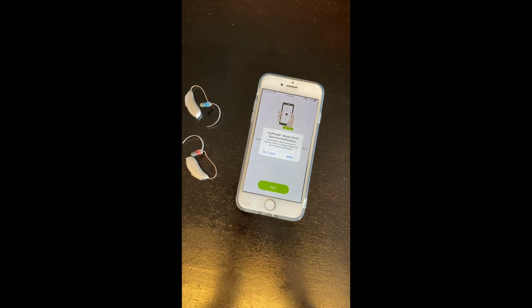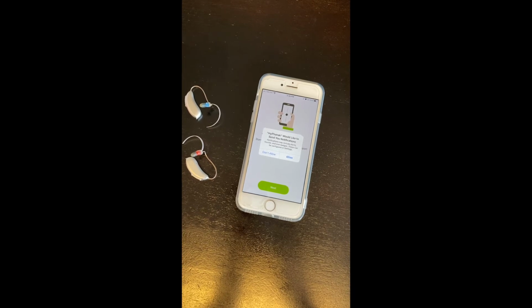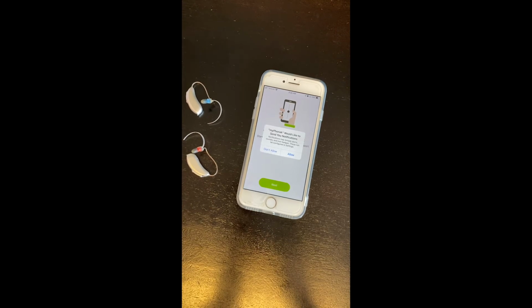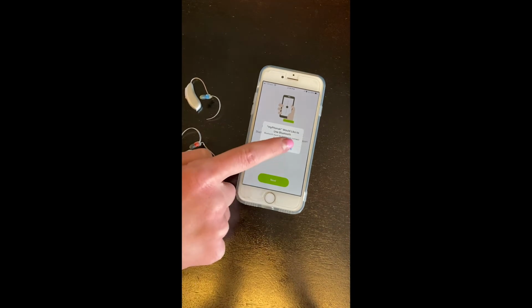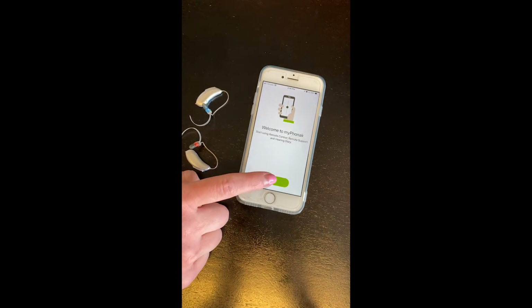It's asking if you would like it to send you some notifications. If you're a person that likes to know what's going on with your hearing aids, you can press allow. I personally don't want any, so I'm going to press don't allow. Now it's asking if it can use Bluetooth. You want to press OK to that, so it uses the Bluetooth. And now we're going to press next.